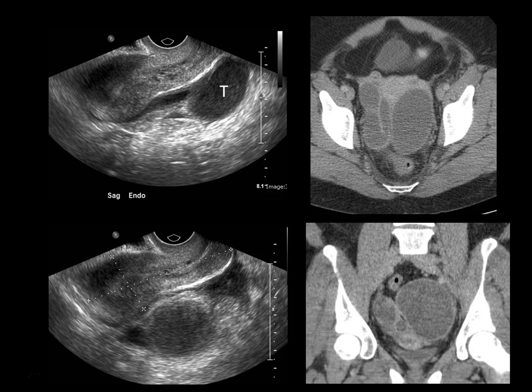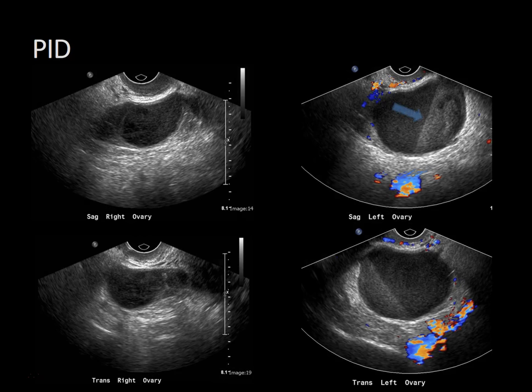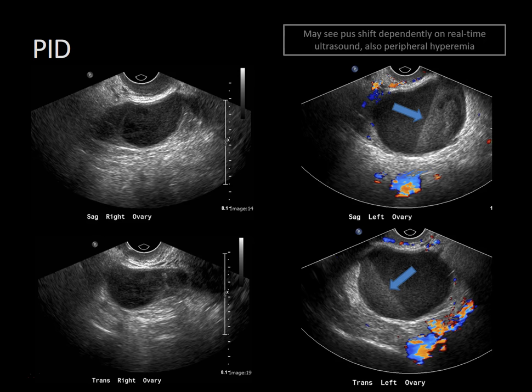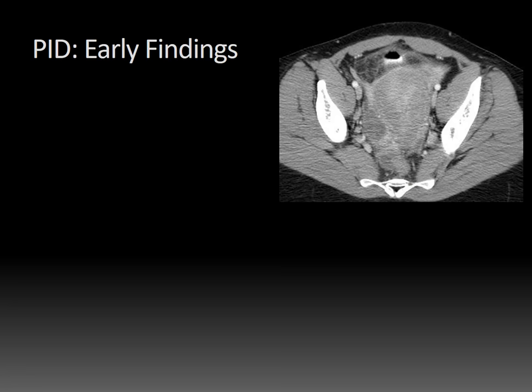This is that same patient on ultrasound, showing that the tubes are dilated, fluid- and debris-filled, and located posterior to the uterus. Additional images show an actual pus-debris level that changes position with the patient, and there's also peripheral hyperemia — common findings in PID. This patient underwent bilateral ultrasound-guided drainage.